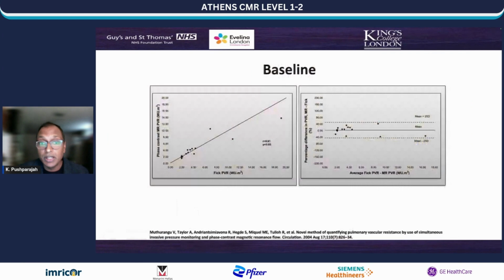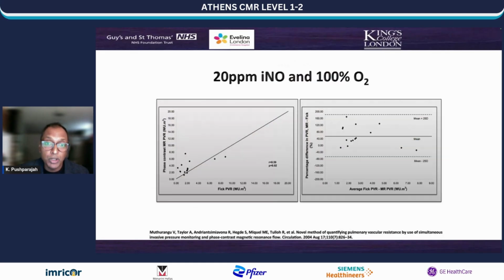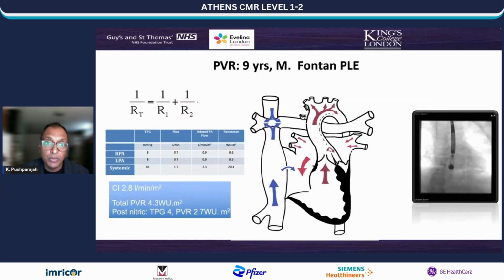So what I'll show you in the next series of images is how work done, again, historically, shows that PVR estimation in this way is much more accurate than the Fick approach, both at baseline and also when you move in with nitric and 100% oxygen.